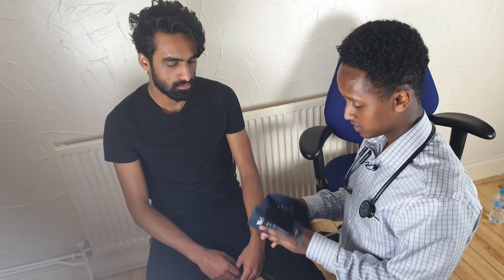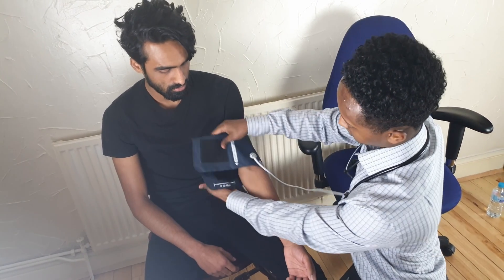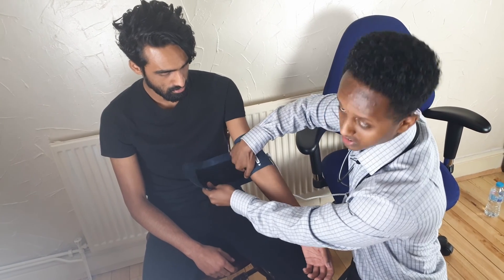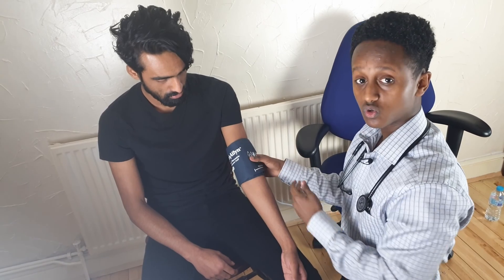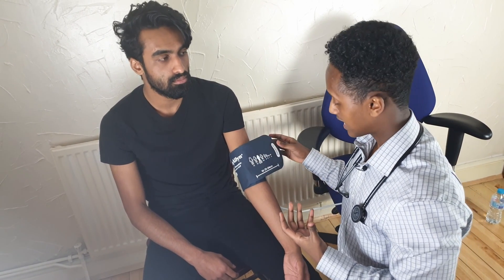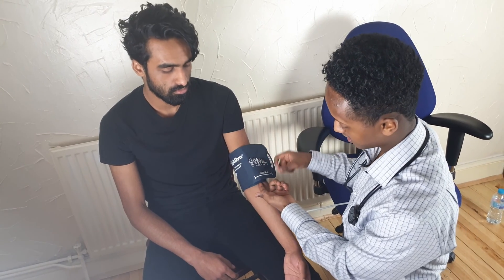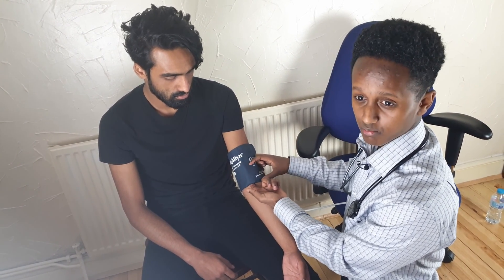You put the cuff around the patient's arm. The best way to do this is to look for the arrow and line it on the brachial artery, which is medial, just here. It doesn't have to be perfectly accurate but rough is good enough. The key is to make it tight enough — not too loose, because if it's too loose the reading will be false and inaccurate. I like to test it by seeing if you can put a finger underneath. If you can, it's probably too loose. Here you can't really do it, so that's perfect.